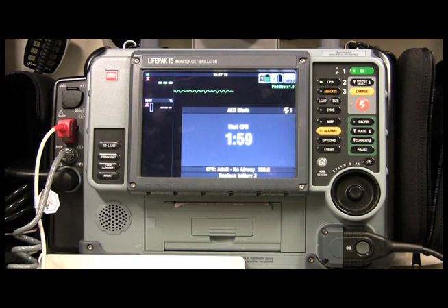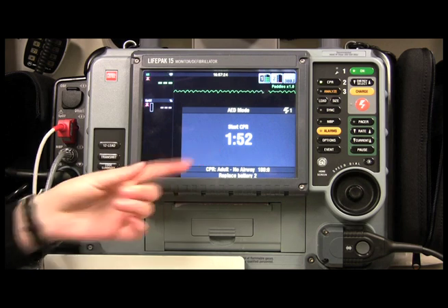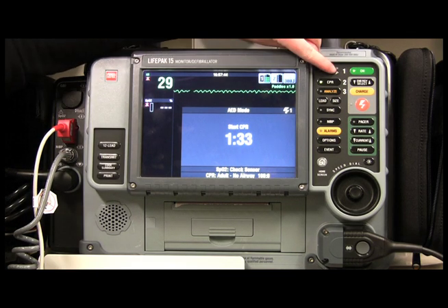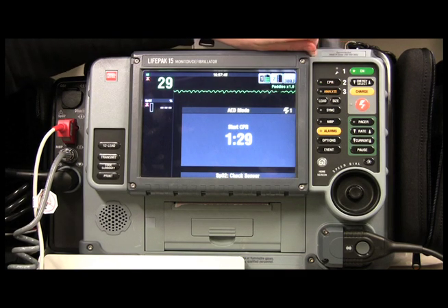Start CPR. Now the great thing about the LifePak 15 is it automatically starts counting down for you, and it also starts the CPR metronome, which tells you how often you should be doing compressions. If you want to turn it off — maybe you've got a headache and CPR metronomes don't mix — all you have to do is come over to the CPR button and click it once and it's silenced.